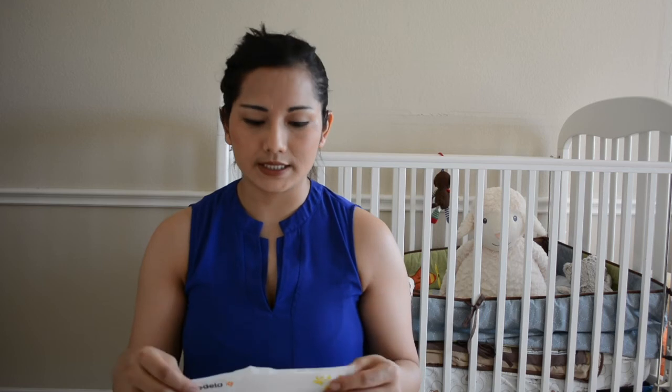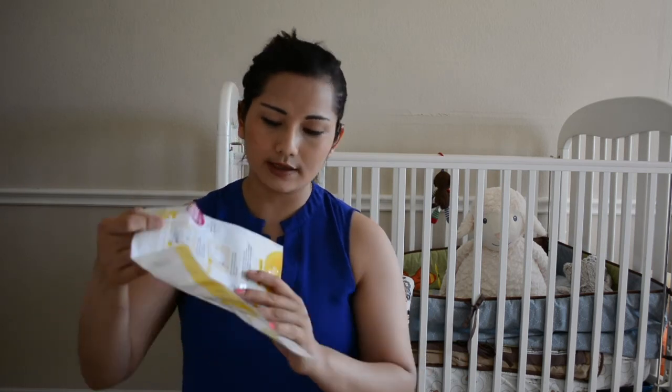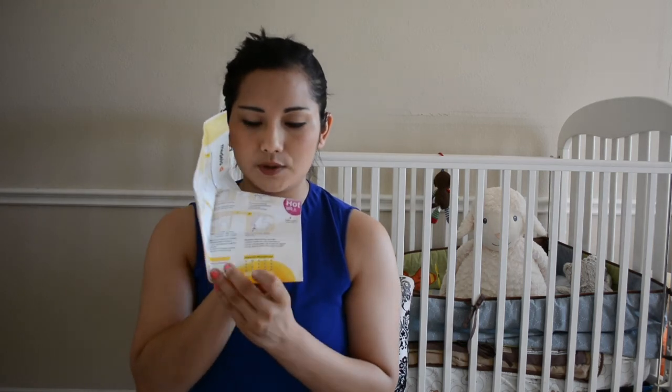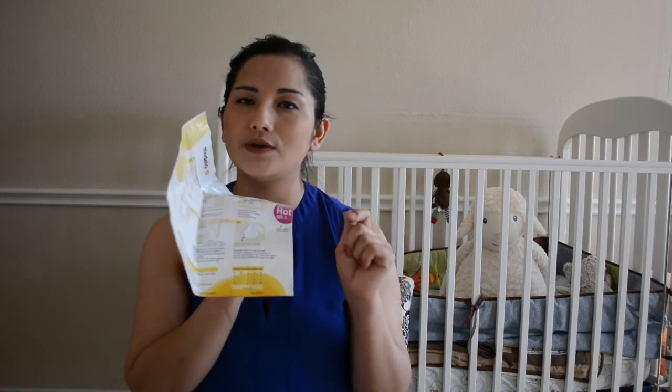Reason number two is the price — it's very reasonable and not expensive at all. Reason number three is that you can reuse the bags many times. Each single bag can be used up to 20 times. There's a little calendar-like tracker on it, so every time you use it you mark it off. Keep a sharpie handy near the microwave so you don't lose track.